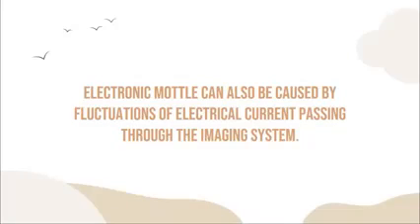So electronic noise can also be caused by fluctuations of electrical current passing through the imaging system. So, na-discuss na ito ganina, electronic noise. Ayan. Okay? Electronic noise, since digital image man ang atua, so your electronic noise can be maglihok-lihok na siya. Okay?